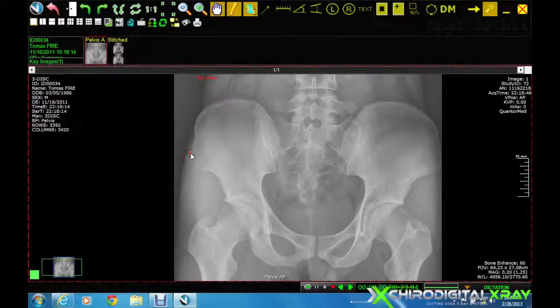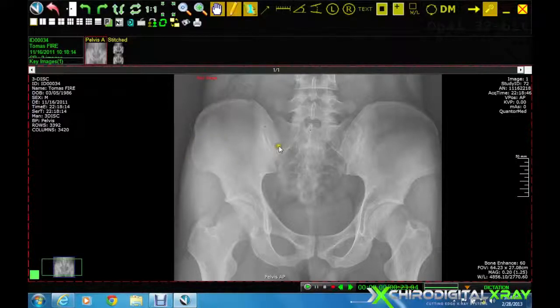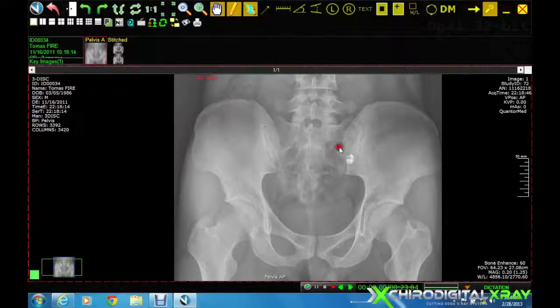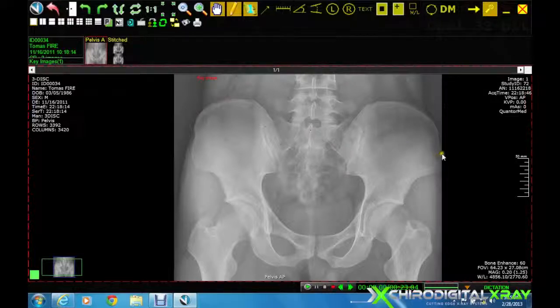Next, the lateral aspect of the left iliac, the lateral aspect of the left sacrum, the medial aspect of the left iliac, the medial aspect of the right iliac, the lateral aspect of the right sacrum, and the lateral aspect of the right iliac.